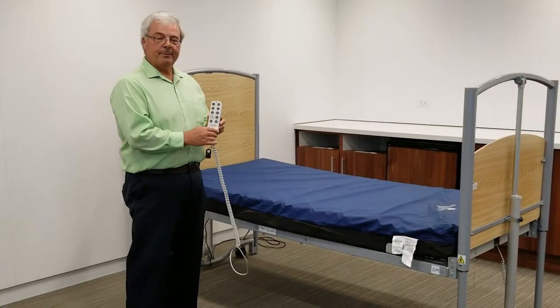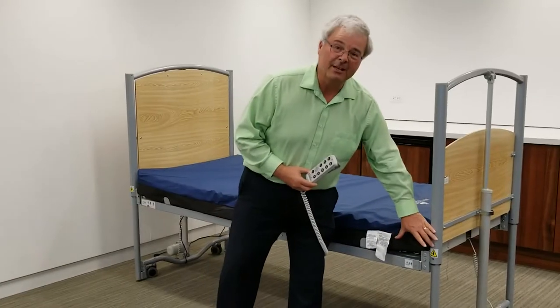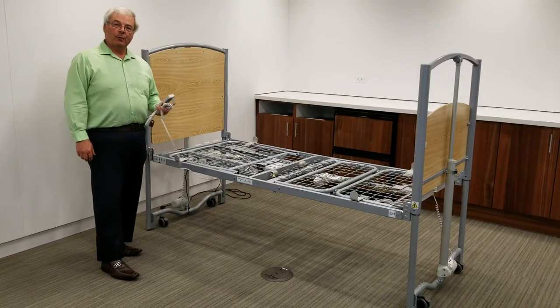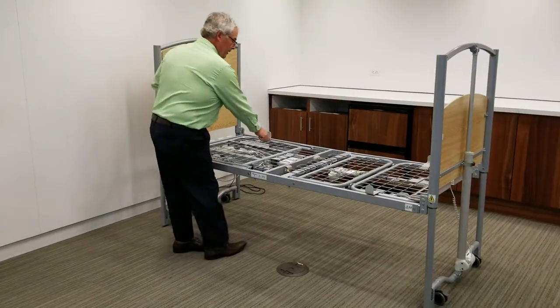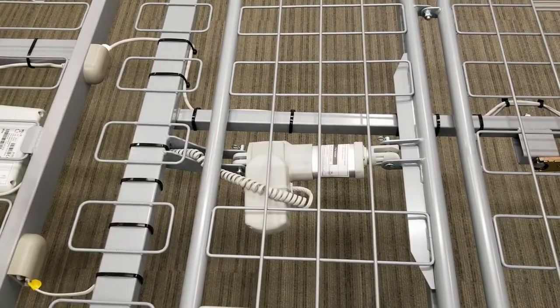The floor bed has the ability to go in Trendelenburg and reverse Trendelenburg, and each bed has the ability to extend four inches to become 84 inches. There's a three-year warranty on the electrical components and a 10-year warranty on the frame. The components are easily removed and replaced from the top.